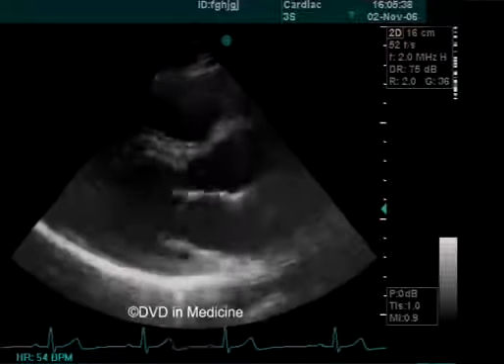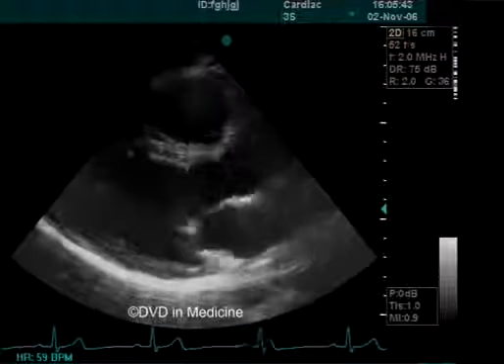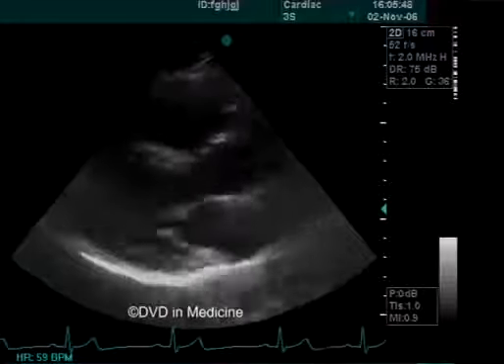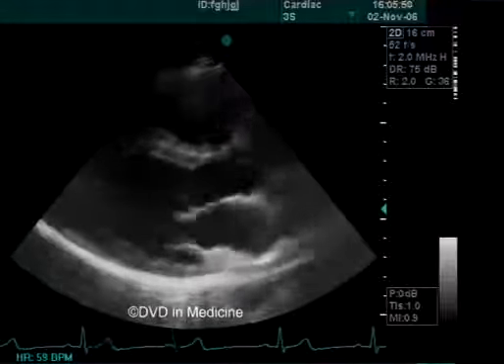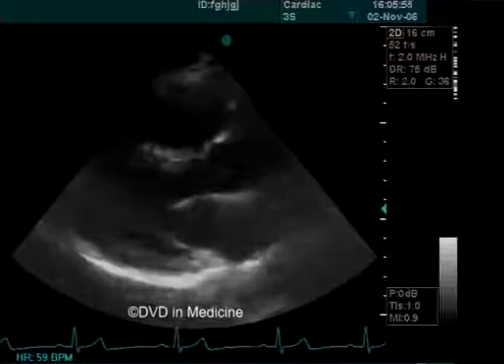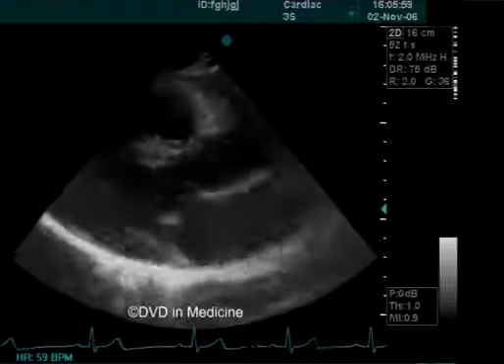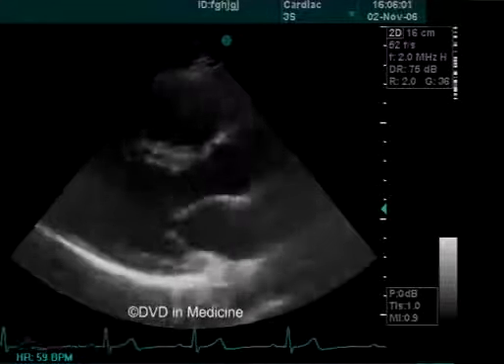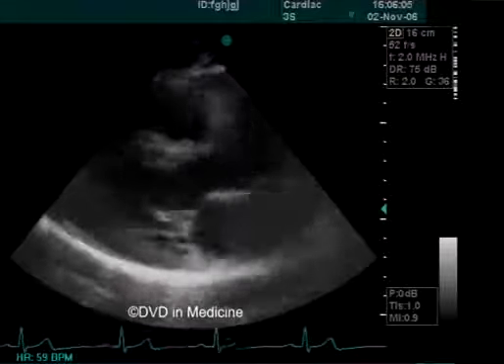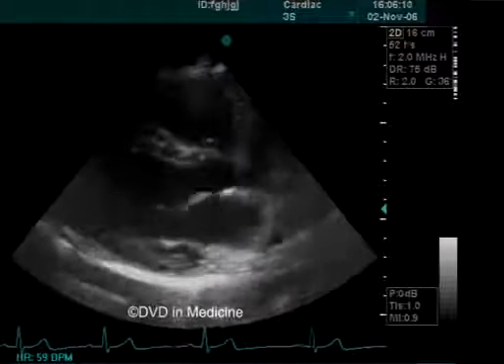10. To assess the left atrium and to diagnose masses inside it, thrombus, myxoma, membrane. 11. To perform quantitative Doppler echocardiography of mitral or aortic insufficiency. 12. To diagnose muscle defects of the interventricular septum with color Doppler imaging or pulsed Doppler recording, and to measure in this case the systolic pressure gradient between ventricles. This pressure gradient gives one the possibility to assess systolic pressure in the right ventricle and pulmonary artery.